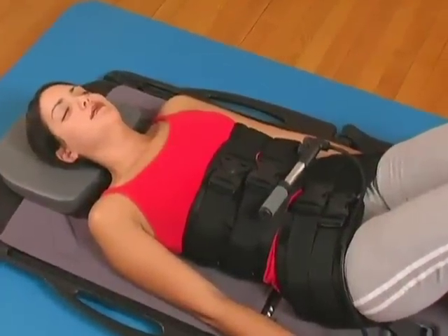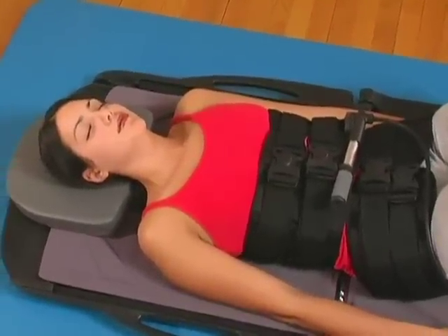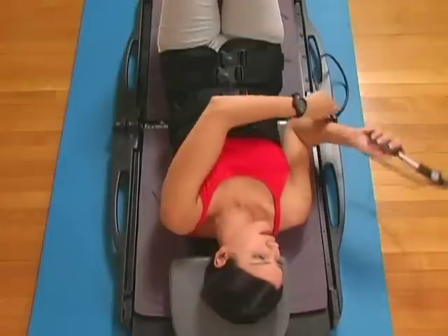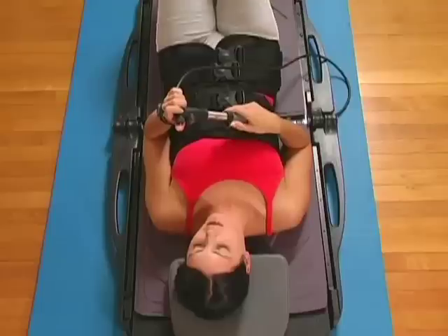In case of an emergency, press and hold the release button until traction is in the neutral position. After the traction treatment is complete, press the release button to reset the traction back to the neutral position.